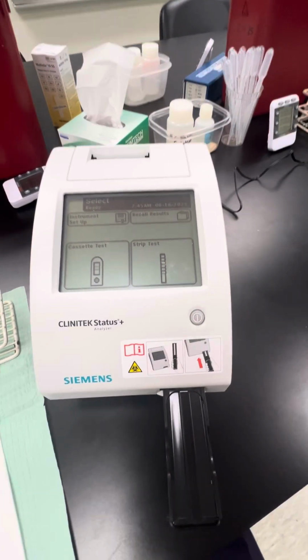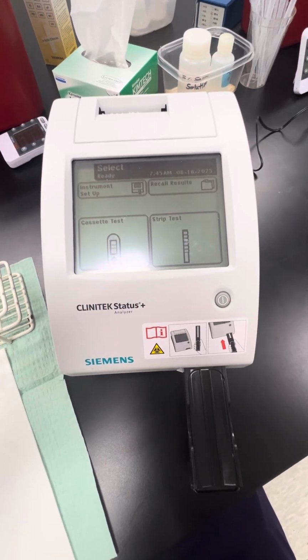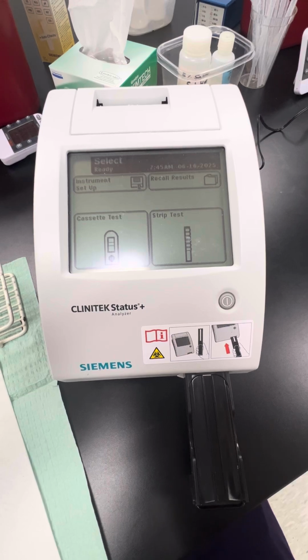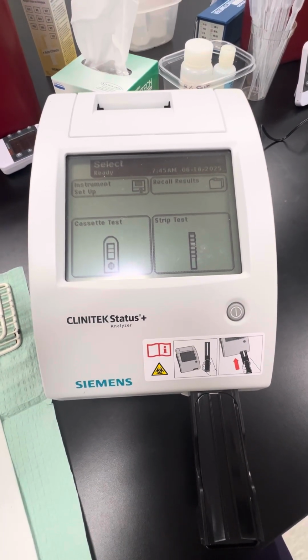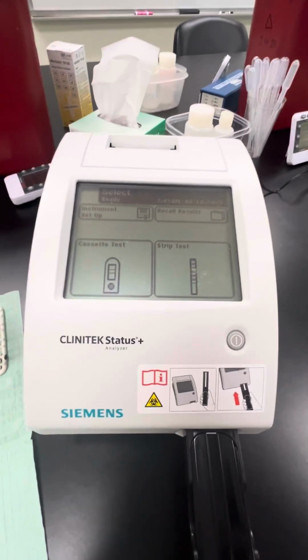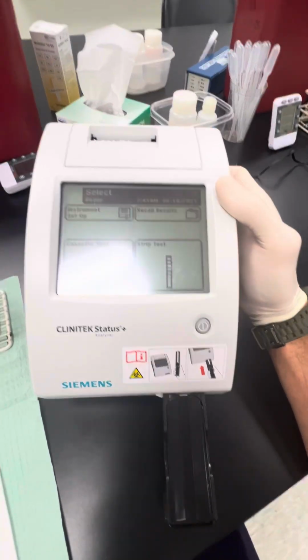All right, everybody. Today you're going to learn about the Siemens Clinitek Status urinalysis point of care device. This is a very common semi-automated urinalysis instrument that you will see in many labs, doctors' offices, and so forth. Y'all are going to be using this device for the rest of the term. It is a very straightforward, easy to use, very user-friendly device all around.